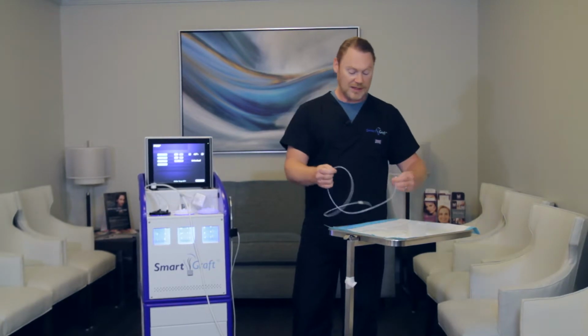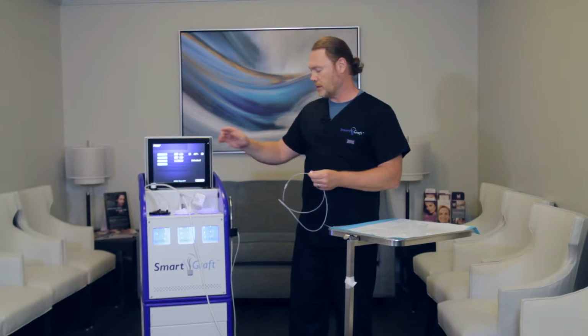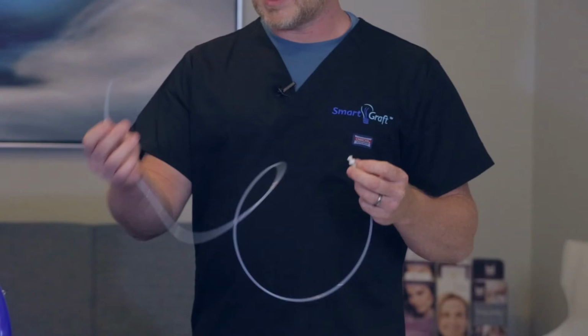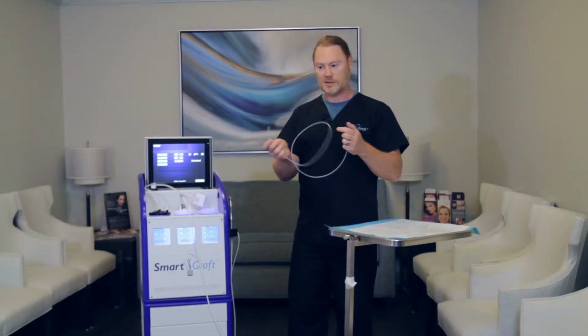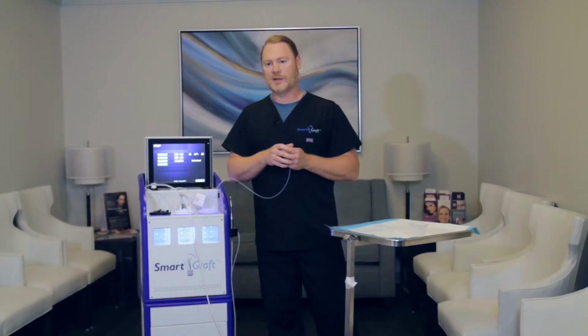The last tube is actually going to be the tube that the grafts come in through from the handpiece into the graft canister. You'll notice there is a connector on one side and just basic tubing on the other side. This tubing will fit into the last hole position where the grafts will go into the basket.